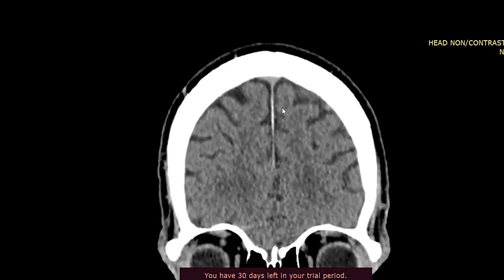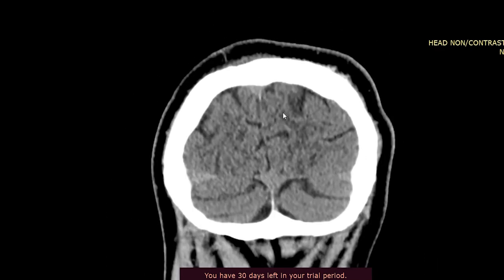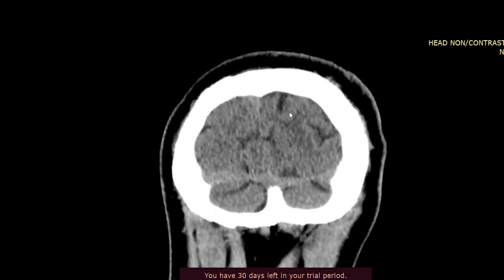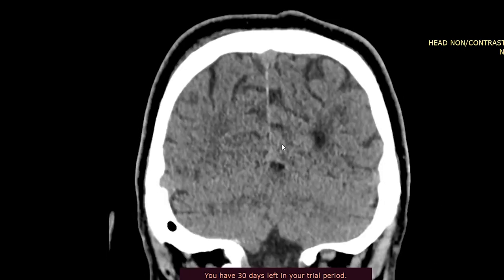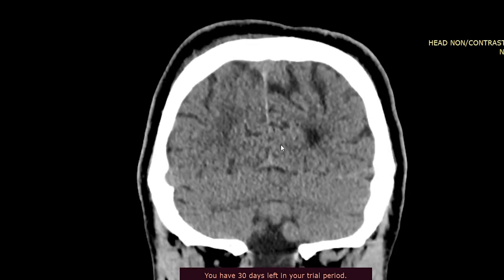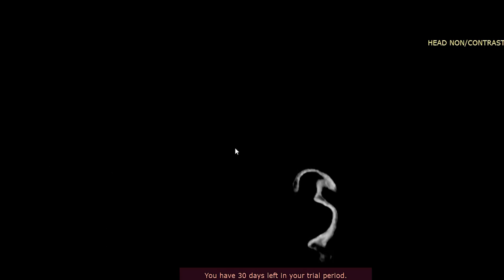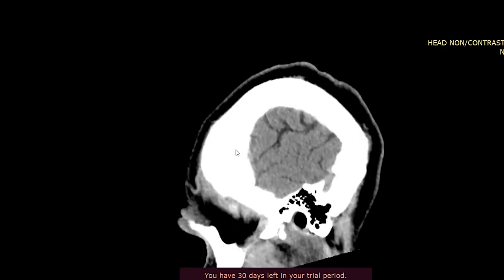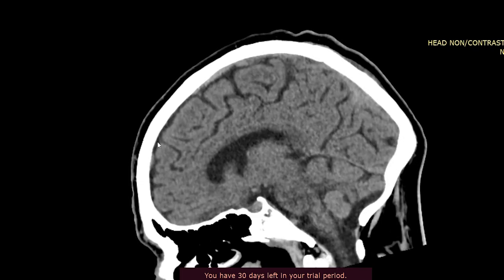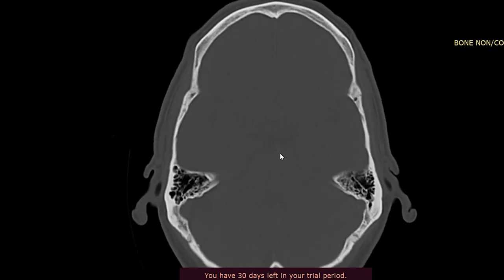So that's all looking fine — we don't see any hemorrhage. While you're looking through the same planes, you're also looking for any masses, which can also be intraaxial or extraaxial. We don't see any on these images. So to summarize so far: we've looked at the parenchyma for edema and sulcal effacement, the ventricular caliber, the gray-white matter interface, and then looked for hemorrhage or lesions in multiple planes — none found.